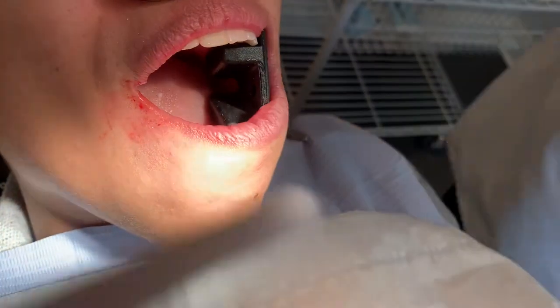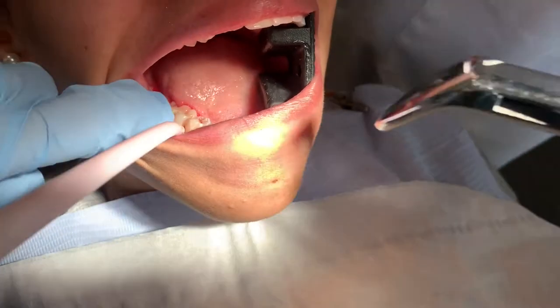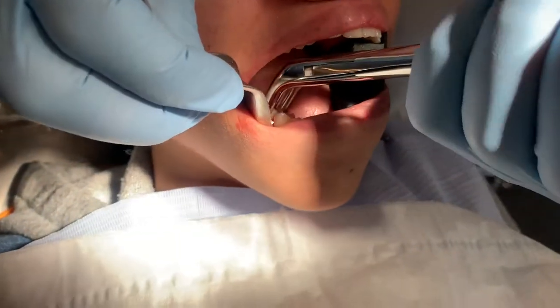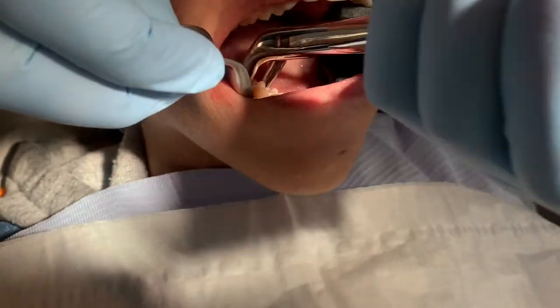Do you feel some kind of deep down pressure a little bit there? Oh, no, she's just upset. I'm sorry. It's okay, guys. Yeah, just relax here. Okay, a little bit of pressure this way, and this way, and this way, and this way.